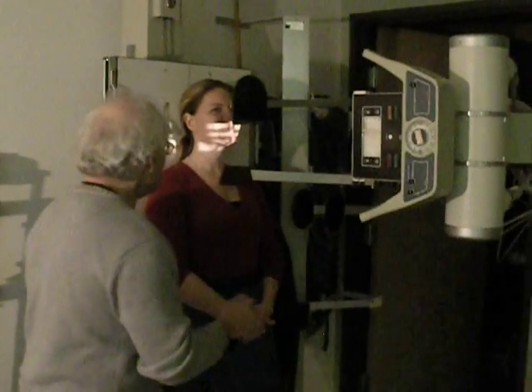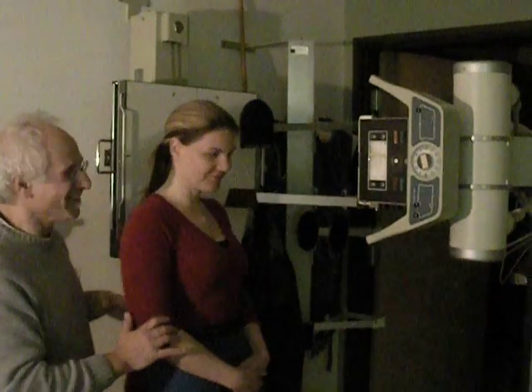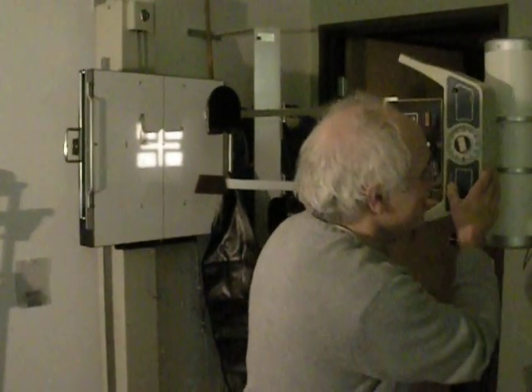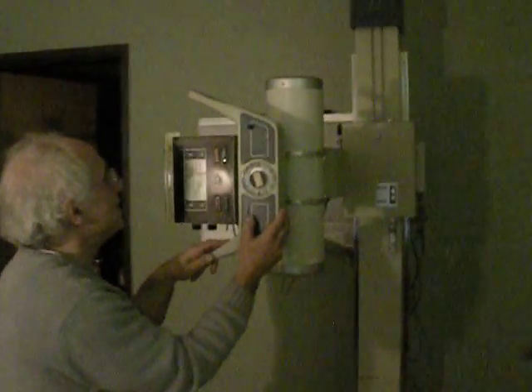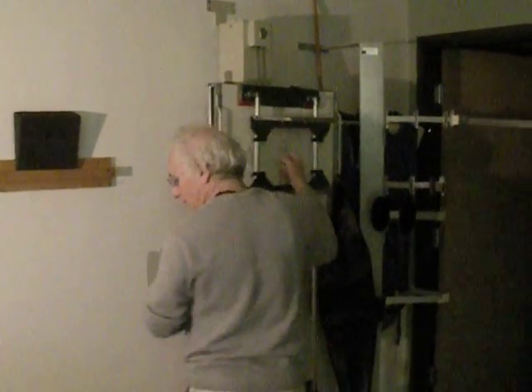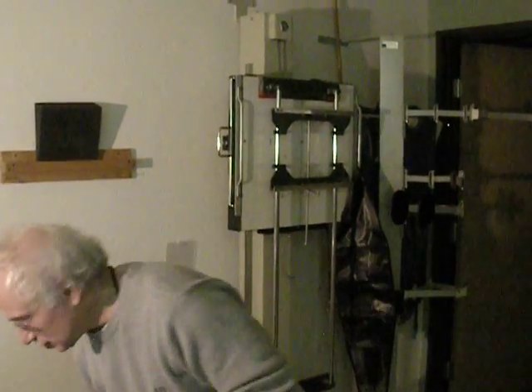That's not a little beep. Won't you step out, please? Thank you. And now we're taking this SID back here to 72 inches. And in this clinic, we prefer to use this non-grid film holder, but we don't push you to do so, since most of you don't have such a thing.